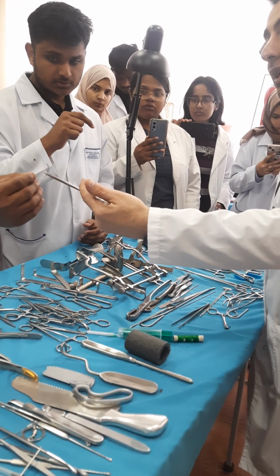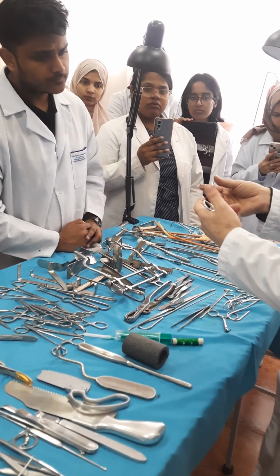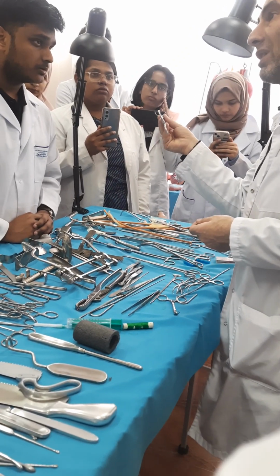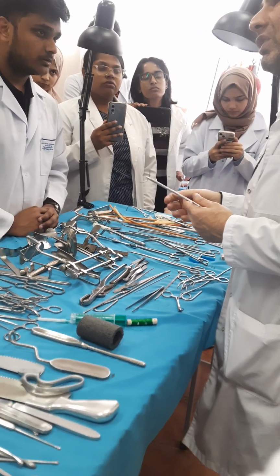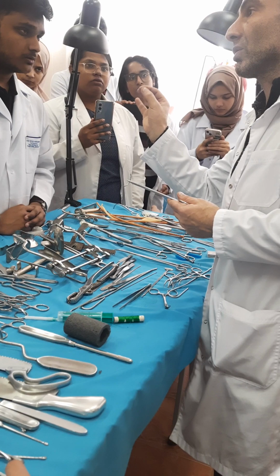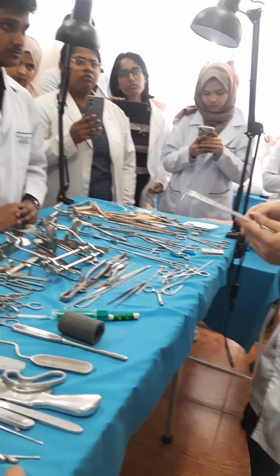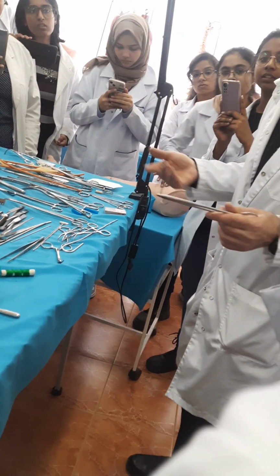So tell me please, in which conditions will you prefer to use this needle, which is called cutting, and in which conditions the round body needle, which, by the way, both can be curved and straight. For skin, which one will you use? Why?